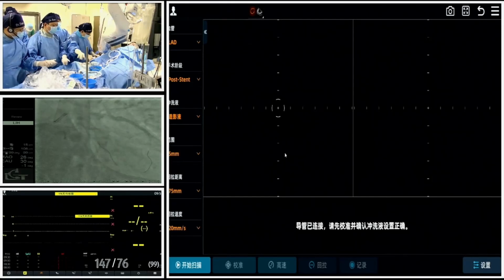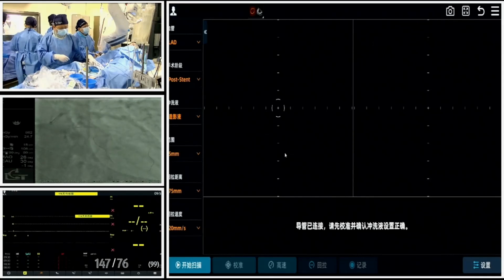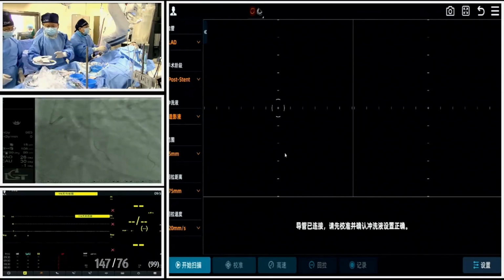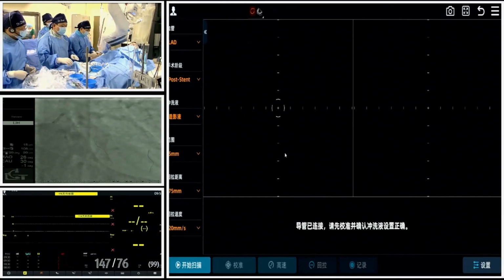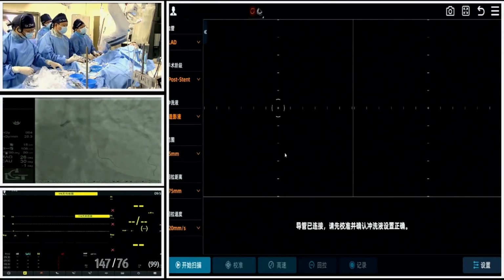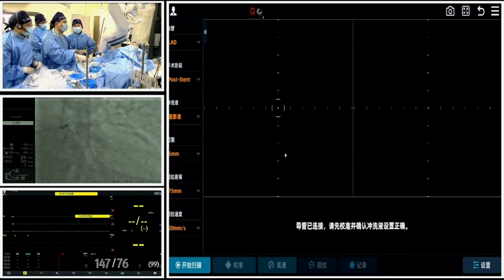So Dr. Gong, can you tell me what's the advantage of the modified KBI? Just the very short overlap, that's it? The modified KBI will be less likely to lead to deformation of the stent in the left main.